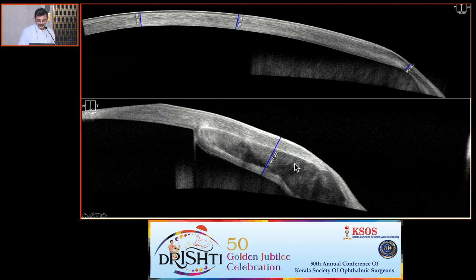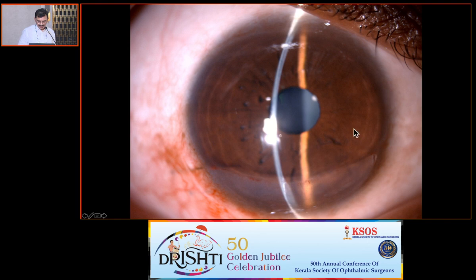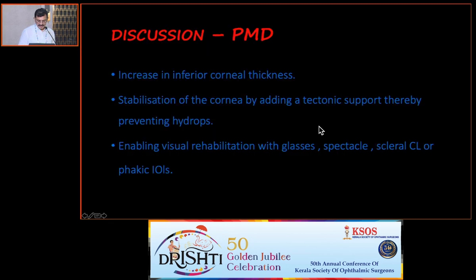And this is the one, for example, this is 200 micron, 250 micron thickness. Now we got 800 micron thickness, and these are the many cases. It's a routine treatment now in our hospital for PMD. And a little bit improvement. Topographically, they are good improvement, but cylinder-wise, it will be more or less the same. And these are some more results.